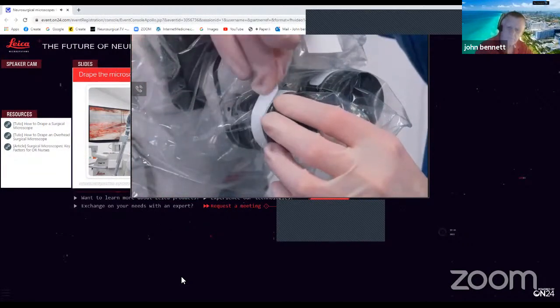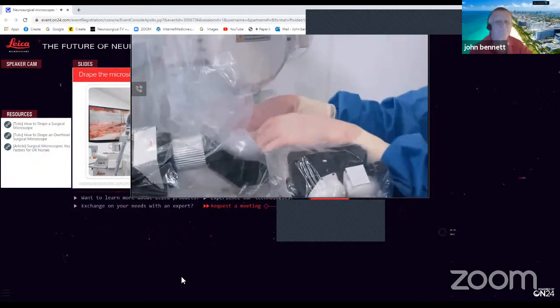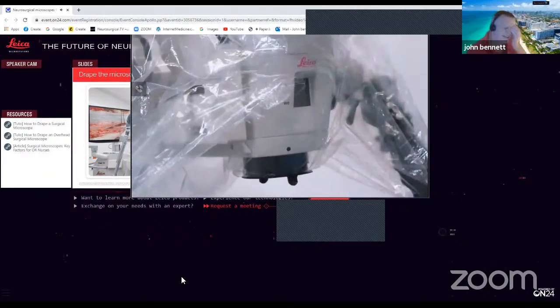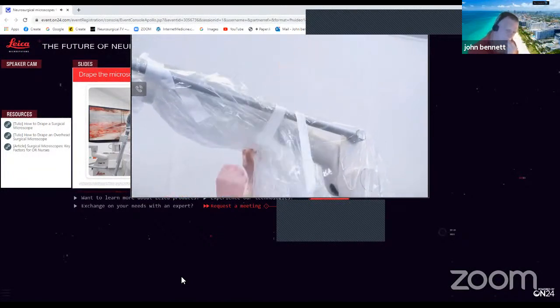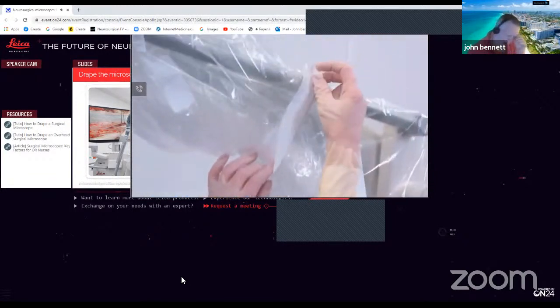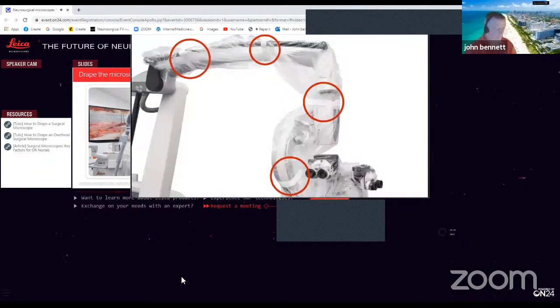Secure the drape using the Velcro straps. Put the remaining drape inside the empty space. Make sure the drape is not covering the lens. Wrap the bands around the microscope head and arm, placing them taped to tape and not taped to plastic, and making sure the drape is fitted airtight to the microscope. Check that the straps are attached around the microscope head and around the arm as shown in the images.